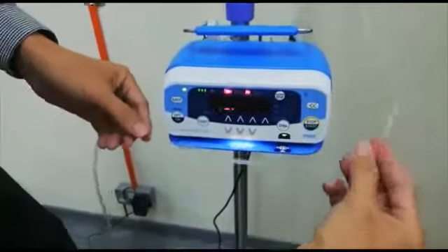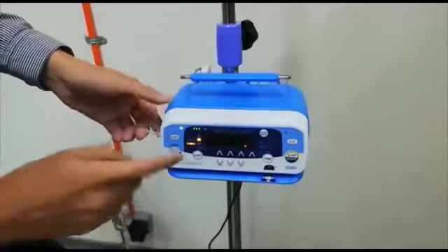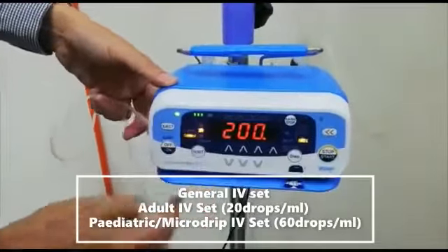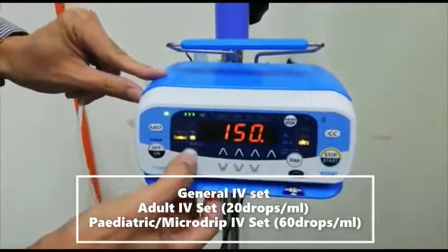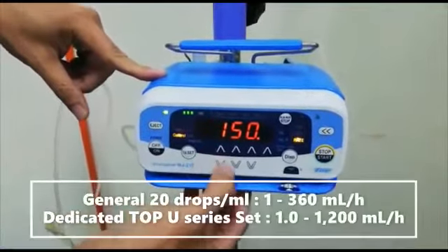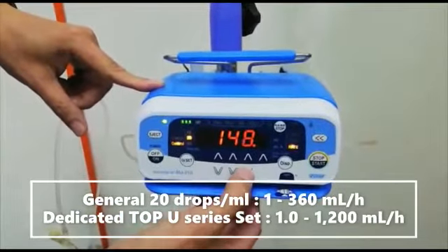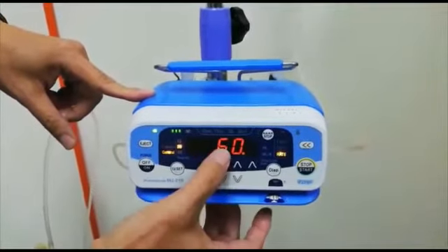Very easy. You just pull this a little bit up, and the pump will automatically attach the set. Now because I'm using general, you should go to general. 20 is the one for adult. If you are using pediatric, you can go to 60. But in my case, I'm using 20, so I go to 20 general. Then this panel is for you to set the infusion rate. You can set the rate here. Our maximum is 360. If you want to reduce, you just press accordingly. It rolls down. Let's say you want 60 mil per hour. That means in 1 hour it will deliver 60 mil.